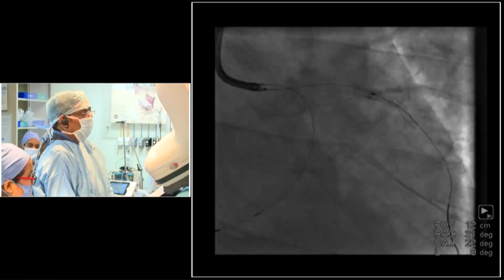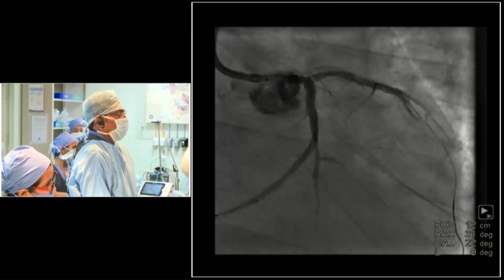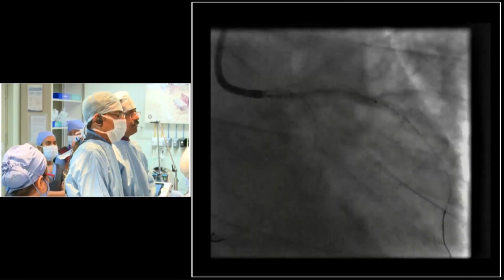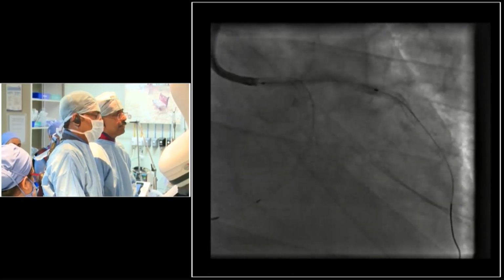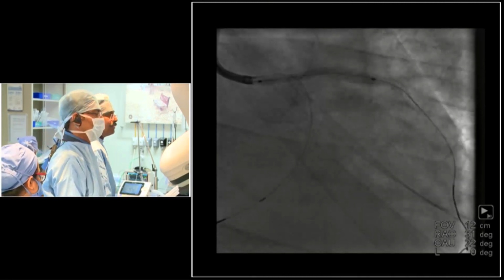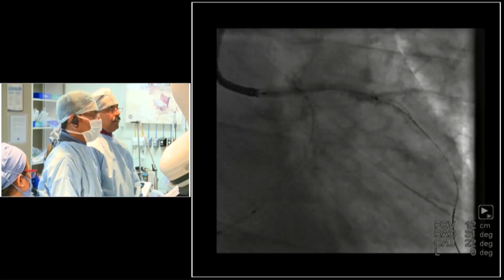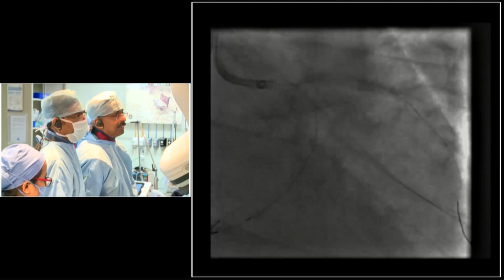So you can see that another 30 would be okay, I think. I'll just go. So, Bhubadi, we are just dilating it to check whether the expansion of the proximal part is adequate. What do you think? Is it okay, or do we have to crack it with a 3 balloon? The ostioproximal segment doesn't appear good, no, sir? Yeah. Maybe we can use the 3 balloon. The vessel is a little bent on one side, so I don't know whether it is.